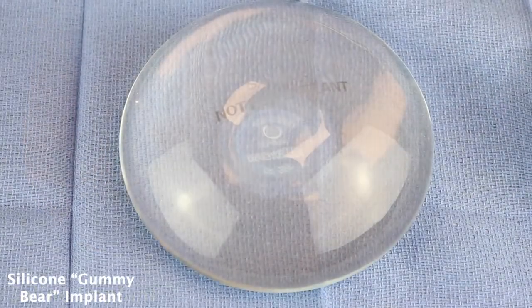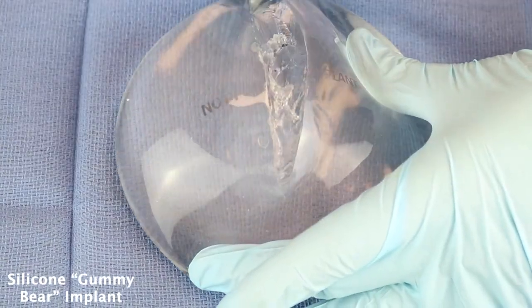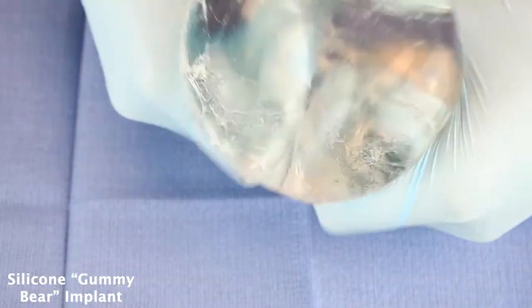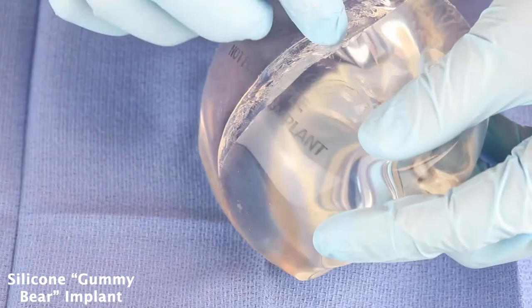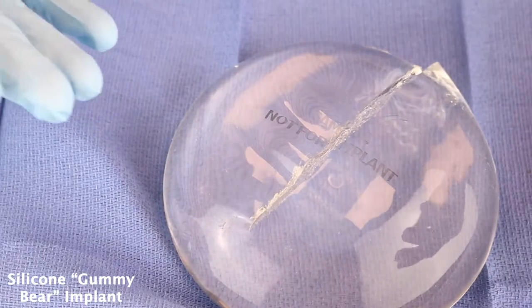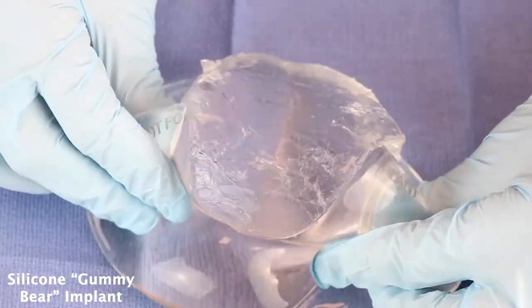This is one of the newer gummy bear implants. It's got cohesive gel, so when you cut it or if it ruptures, it stays in place. I'm opening this thing up and attempting to squeeze all the gel out, but it actually stays in place. This would be a really serious implant rupture inside of somebody, but you can imagine with a small little rupture it's really not going to make the gel go everywhere — it's going to continue to hold its shape unless you totally take it apart. I can't even do it with my maximal force. I think this is a very safe implant, and if it ruptures, it's not going to make a huge mess.